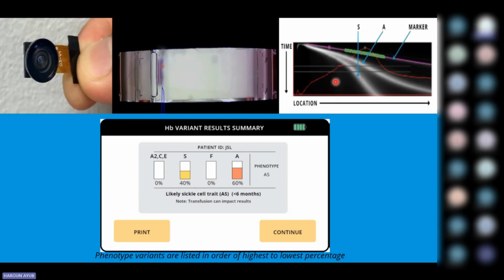So we have the location, which is this particular distance. At the back end of the software, this is how it's seeing the representation. It's representing it as a wave band. You'll find the S band will be represented at this particular level. A2CE will be represented somewhere here, and so on. Remember, as I said, depending on the time, as we move on in time, these particular aspects are migrating and the location will move further.